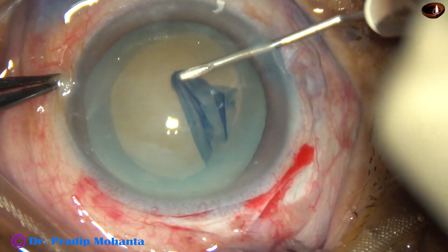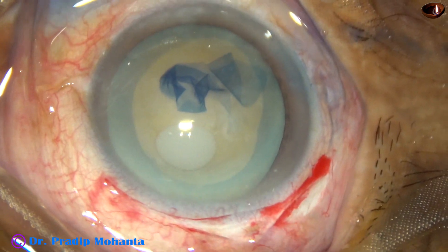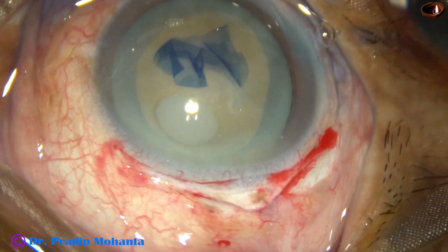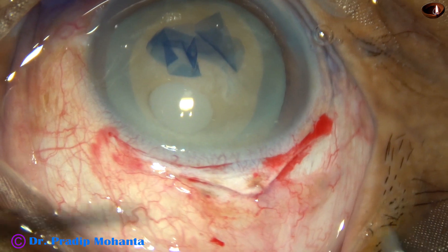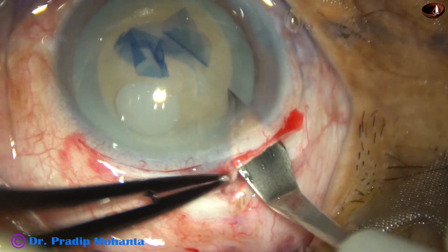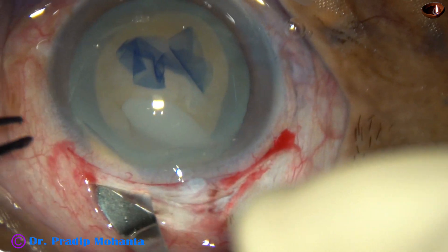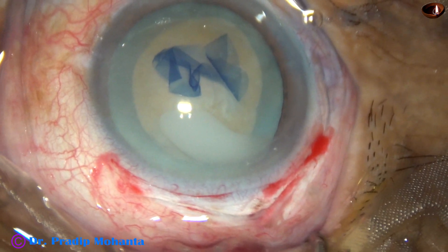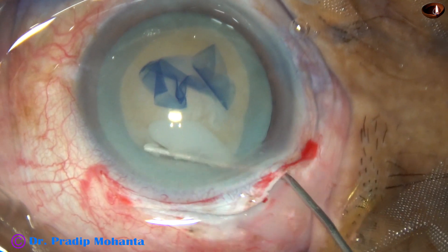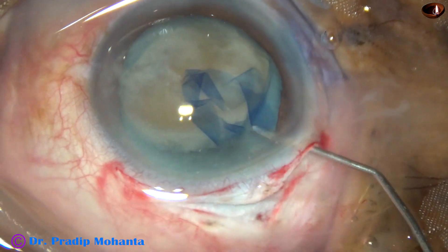In this case, I am planning to prolapse the nucleus just by hydrodissection. The rhexis has been done. Some viscoelastic is injected to keep the IOP on the higher side because we are going to open the tunnel. Now I take the keratome, go to the anterior extreme of the sclerocorneal tunnel, and enter into the anterior chamber, then open the tunnel completely — cut as we go forward. Now hydrodissection: it is actually not necessary, but I am doing it just to prolapse the nucleus. Yes, it has come out.